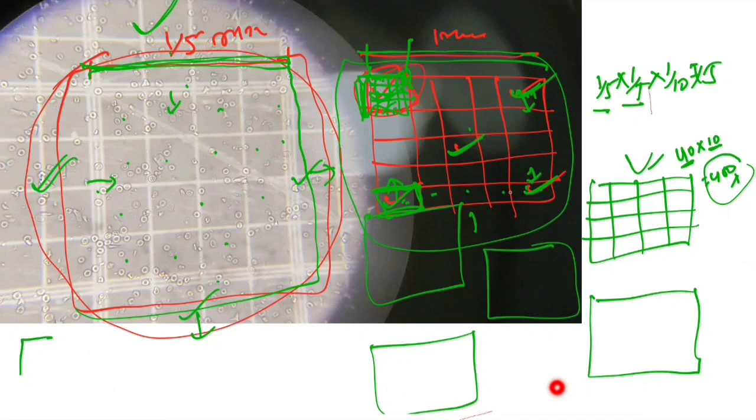And now the thing is that the central line is a reference line. So we have this, all the lines are central line, triple line. All these triple lines we have, and inside that we have 4 lines, 16 lines. So we are not going to discuss that line now. We are actually discussing the triple line. So we have triple line here, we have triple line here, and suppose by chance we are going to count all the cells, all the 25 cells.